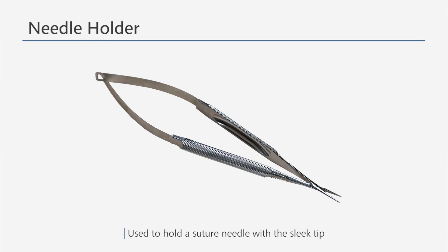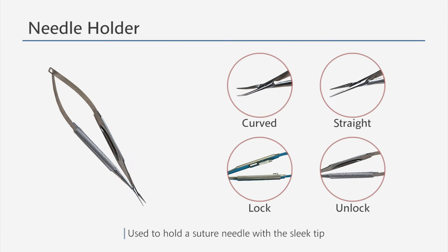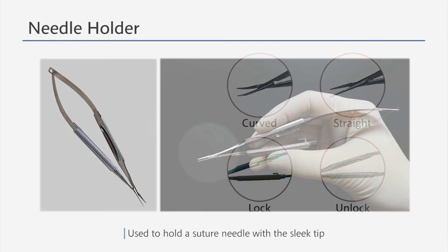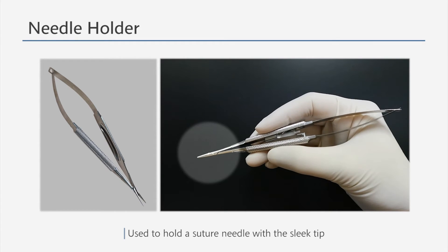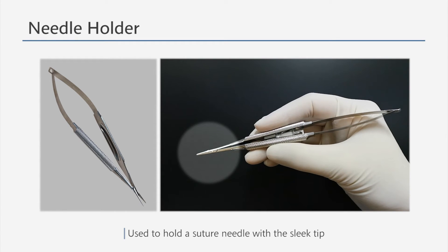A needle holder is used to hold a needle and to ligate a vessel. Its tip can be either straight or curved, and it can be capable or incapable of locking. If a needle holder has a locking feature, you can lock it by squeezing the handle until it clicks, and unlock it by squeezing again.